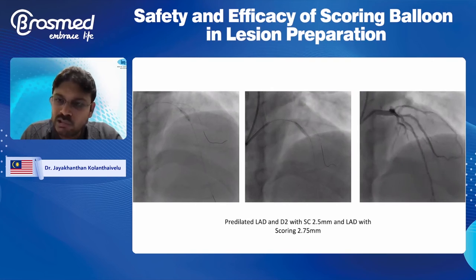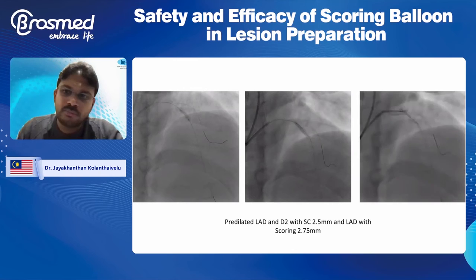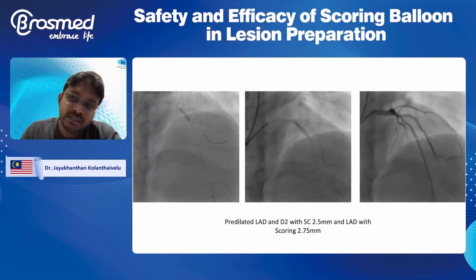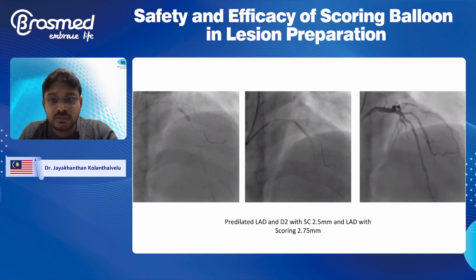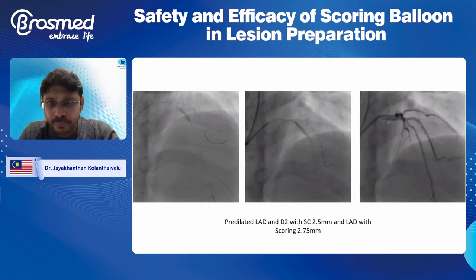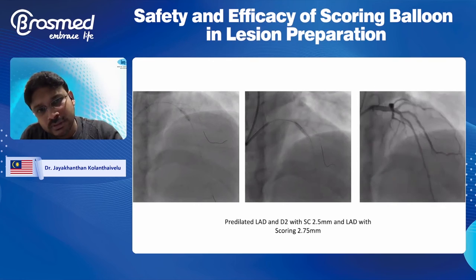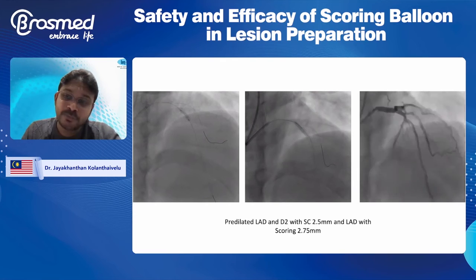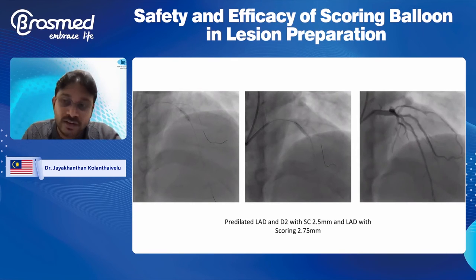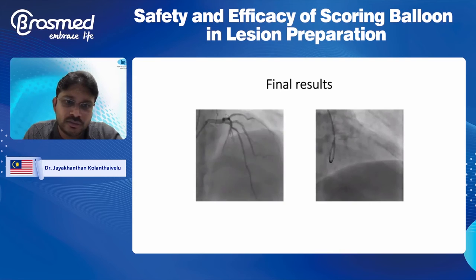I mean, there could be a huge argument here that, look, it's a young 36-year-old male, probably a 3.0/3.5 vessel, but the idea is, this is a young chap, totally occluded lesion. The idea was I wanted to put a drug-coated balloon and see how it looked, and hence why I undersized it a bit. I mean, probably these were during my slightly younger days, not that I'm too old now. So, I chickened out a little bit, used the 2.75 scoring, put a 2.5 DCB in the diagonal and a 2.75/40 in the LAD. And these are the final results.